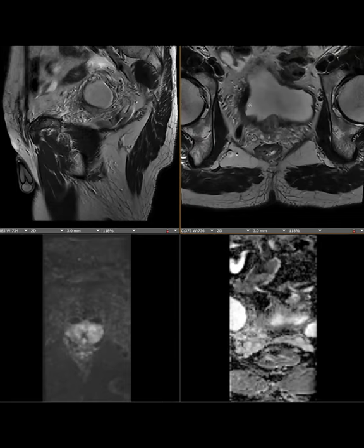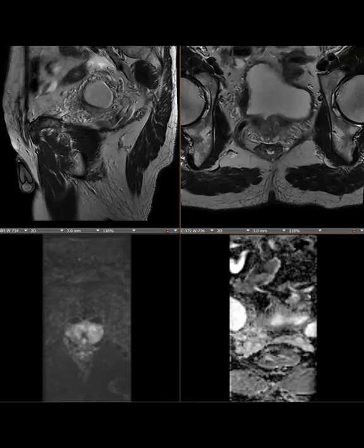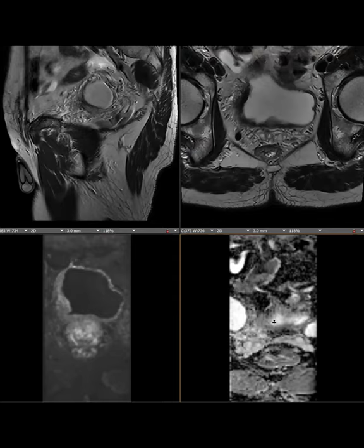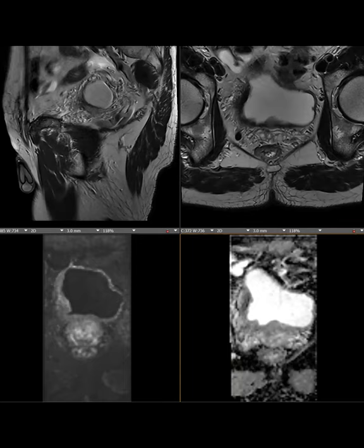So the prostate was fine. There was no suspicious lesion, but there was an extra-prostatic finding. This abnormal thickening that's T2 dark. It doesn't really restrict very much. Not a lot, maybe a little bit. I don't know. But you know, it's not another one of the dictums. So this one, dictum.